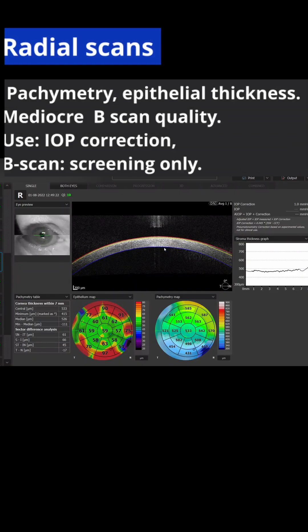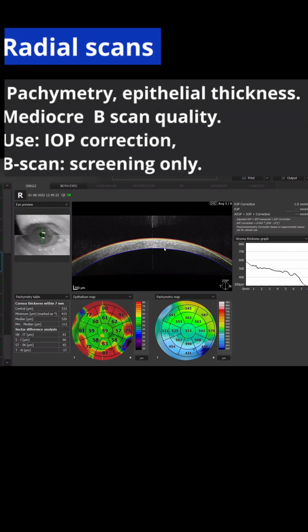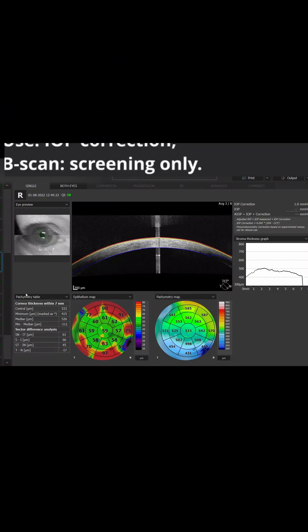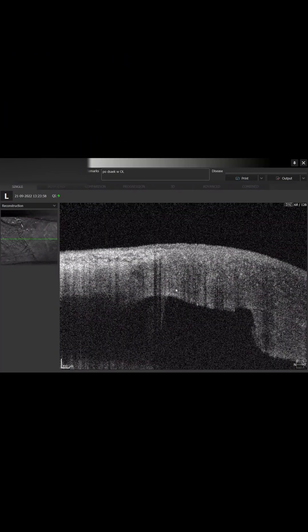Then we have the radial scans. Radial scans also have pachymetry and epithelial thickness. The B-scan quality is slightly better than the refractive.